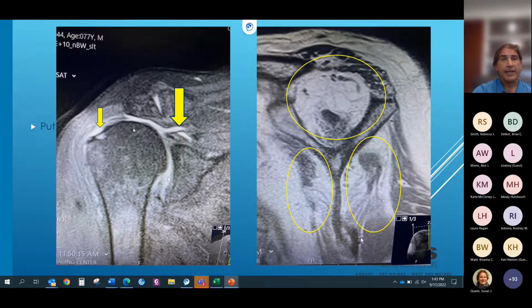You can see how close the humeral head is to the acromion process now. And you can see down here is the bottom of the socket, that this part of the ball used to be down here at the bottom of the socket. And so everything's moved upward, and what'll happen is it'll start to wear a socket into the acromion process up here, which almost makes another socket. We call it acetabularization of the acromion process. And when you see this upward motion, it's a lot of times not a fixable rotator cuff tear. So if this space on an x-ray is less than 4 millimeters or so, you won't be able to fix that rotator cuff, most people think.